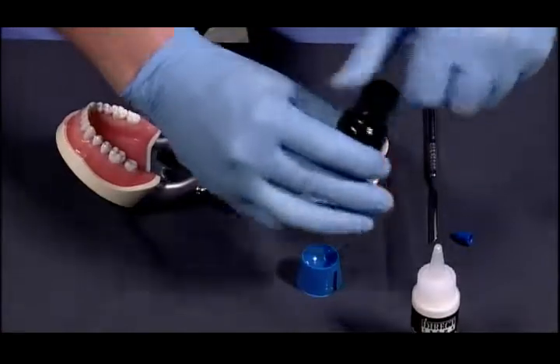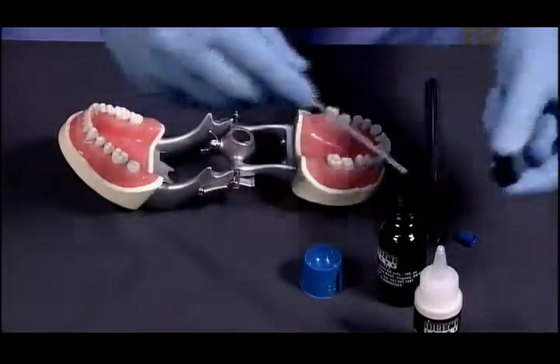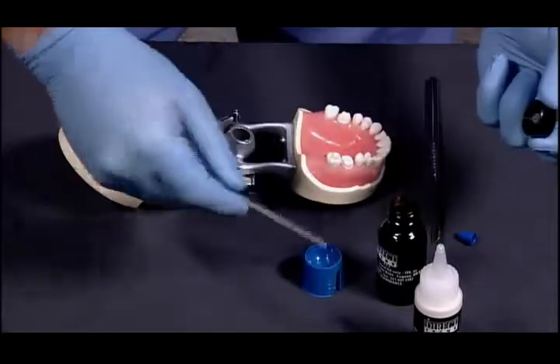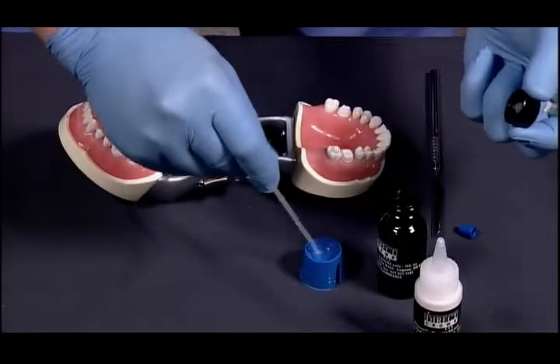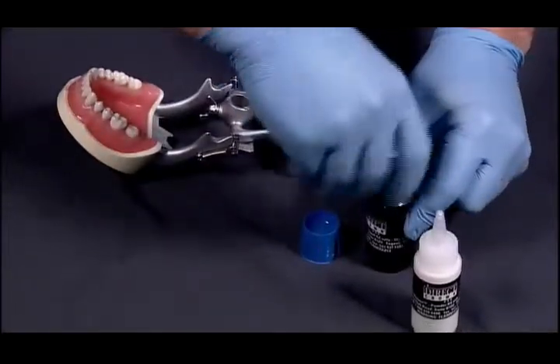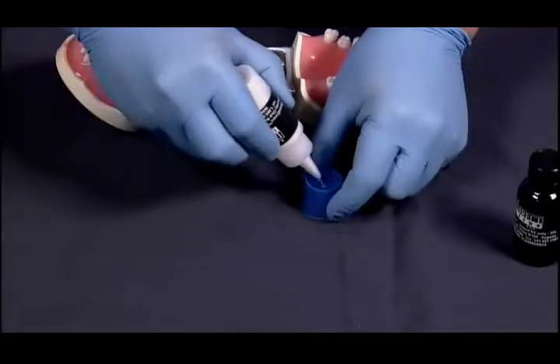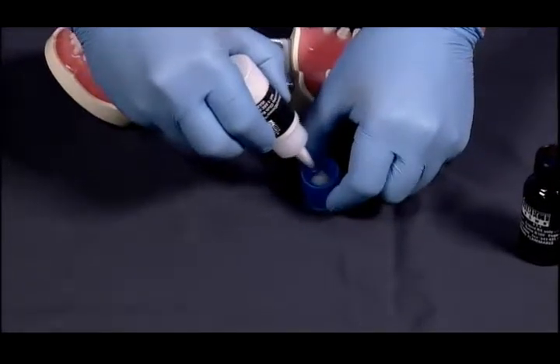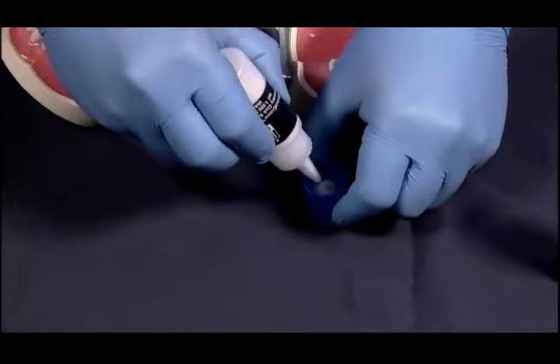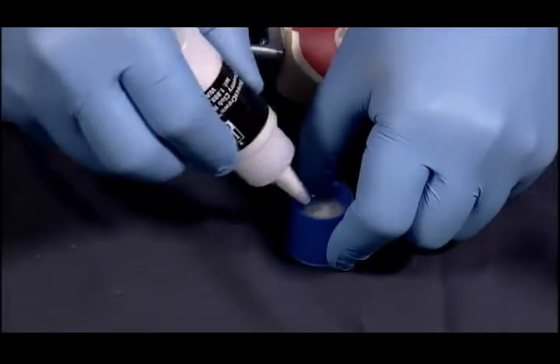Now in this case, we're going to use a very fast setting acrylic that is provided by Direct Crown, and we will take a pipette and remove some of the monomer, put it into the dappen dish, and start to incorporate the polymer or the powder into the liquid. This material sets up in about 2 minutes and 45 seconds, so you really have to move with it.